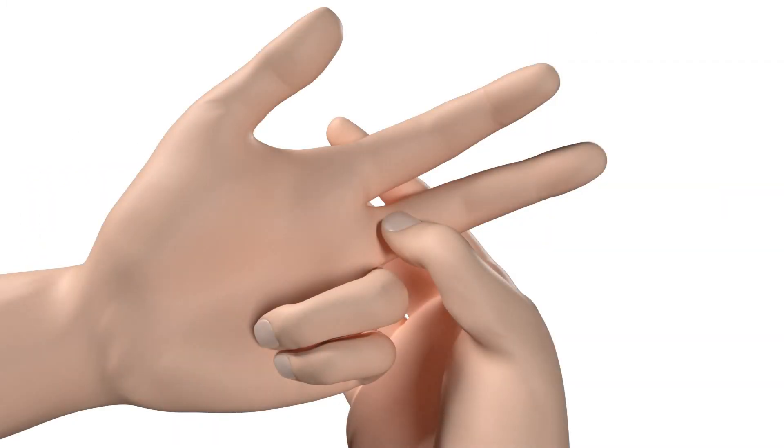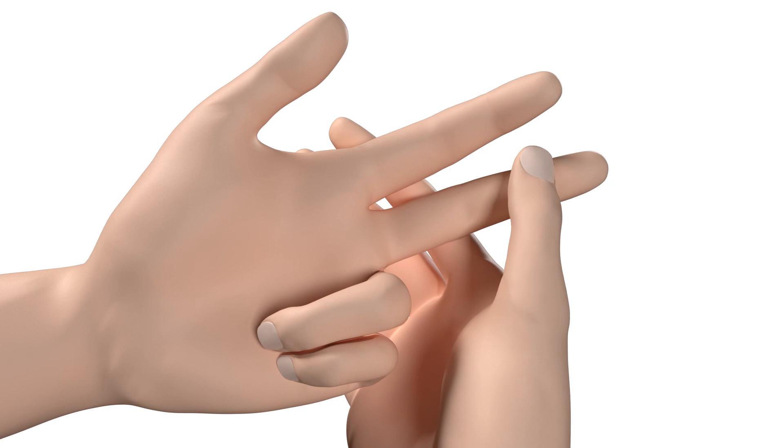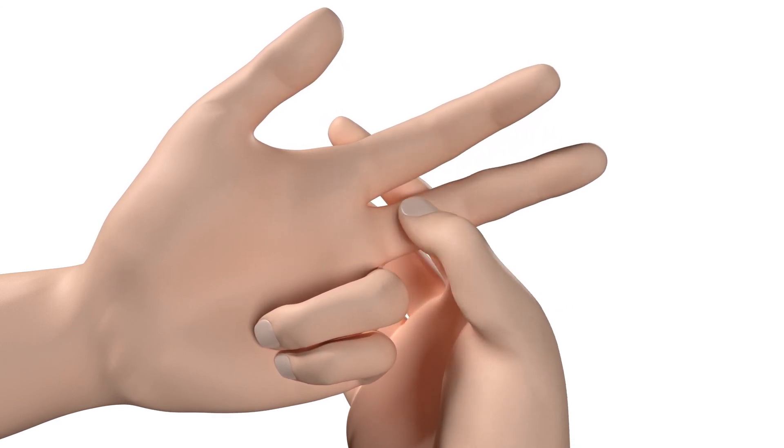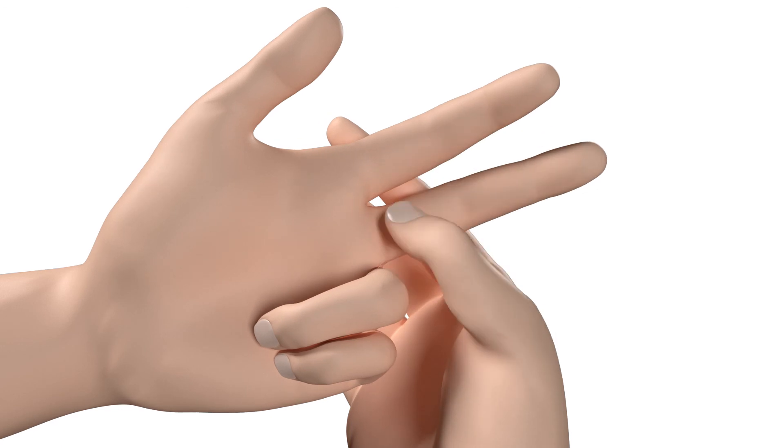Massage your finger for 5 to 10 seconds, making sure it is in an upward motion from the base of the finger to just under the area to be pricked. This will help promote blood flow to the area.